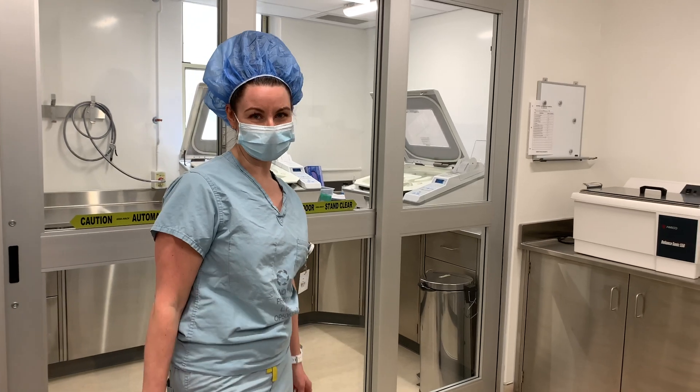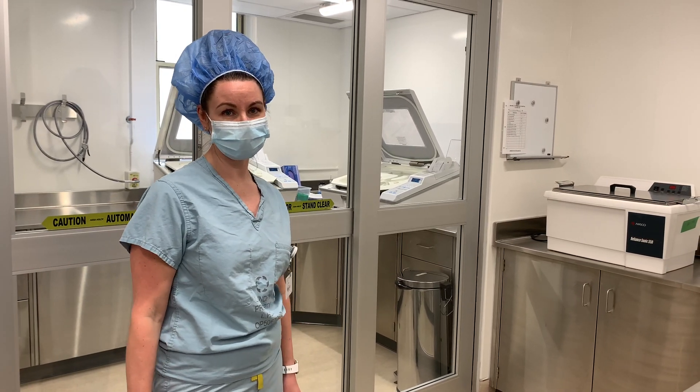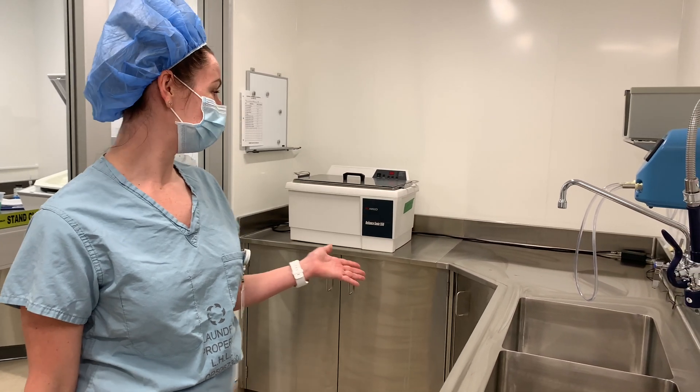After an endoscopy procedure, MDRD staff will bring the soiled scopes down here to the soiled room and they will manually clean them in the sink here.